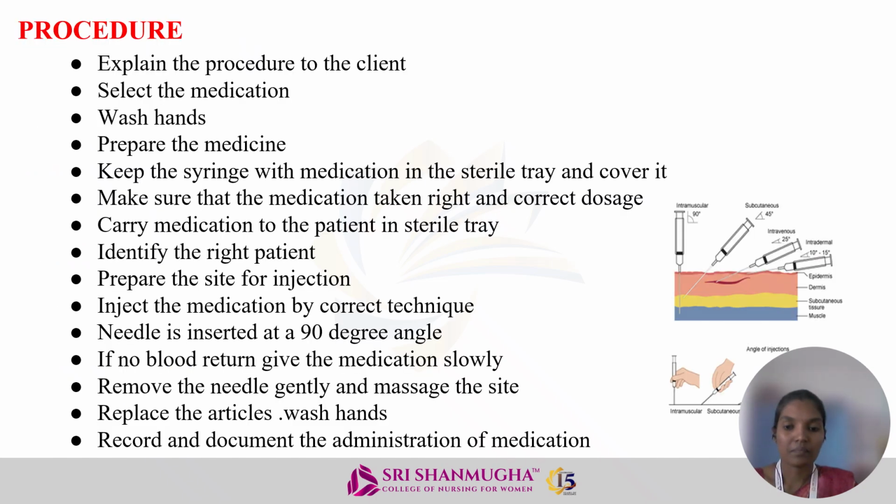Next, procedure. In the procedure, explain the procedure to the patient. Before administering the IM, we have explained the procedure. First, after that, we go to do the procedure for the patient. Next, select the medication. What medication was prescribed by the doctor? We have to administer that.